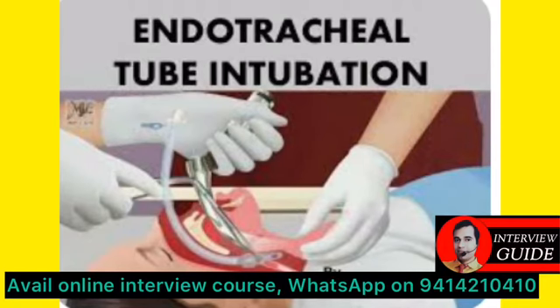Now we have to go behind the head of the patient. We start putting the laryngoscope blade inside the mouth of the patient. Slowly we insert the blade, and during insertion we should take care that no injury takes place to the mouth or the teeth.